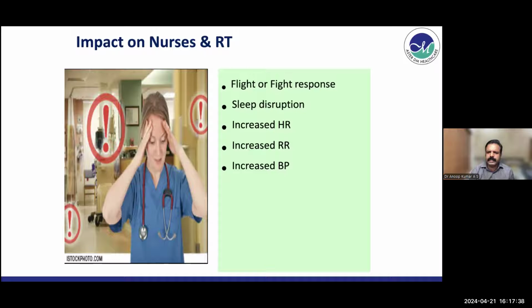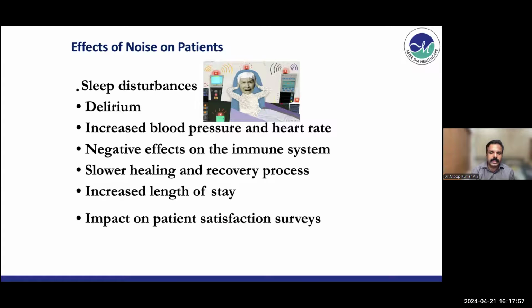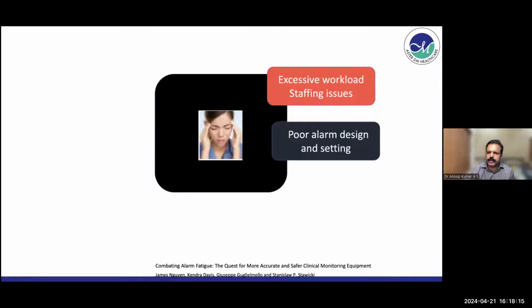So as an intensivist, you should take care of that, and you should train your staff and juniors about this as well. Then there can be an effect of noise on patients as well, like it can produce increased delirium, even negative effects on the immune system, etc. And because of the delirium, etc., sometimes there can be an increased length of stay. And many surveys have shown that this noise pollution has an impact on patient satisfaction surveys as well. And there will be excessive workload, staffing issues, etc.